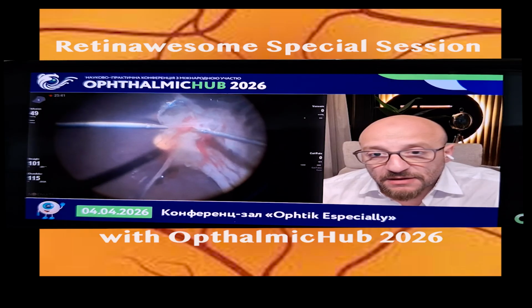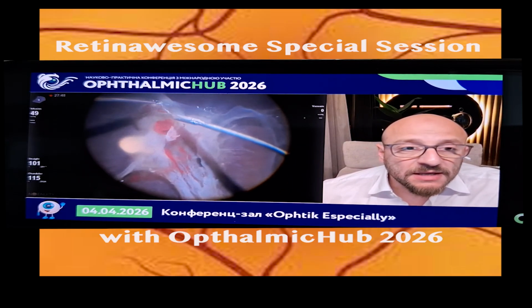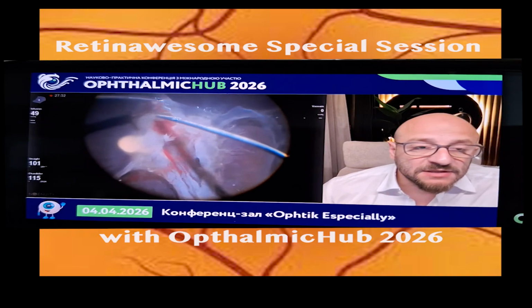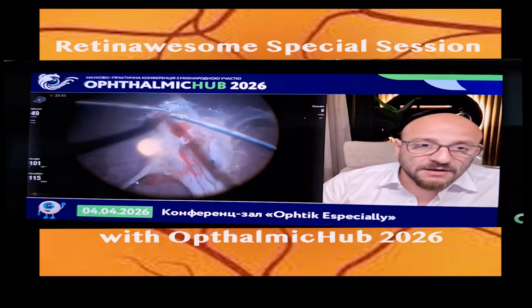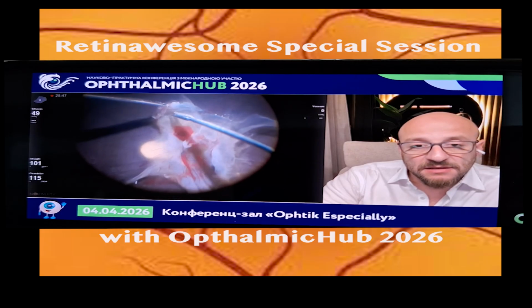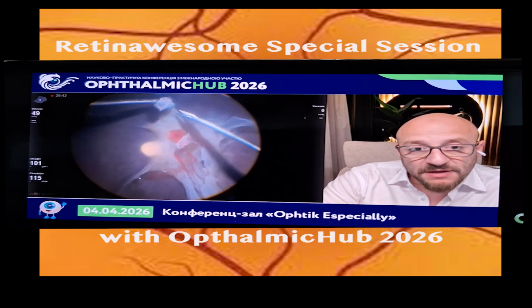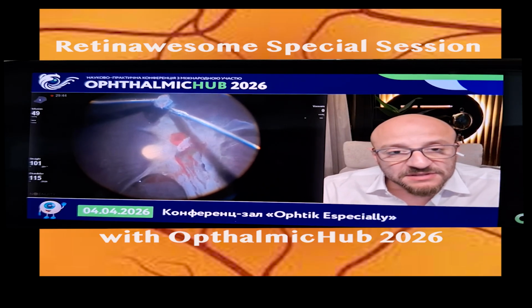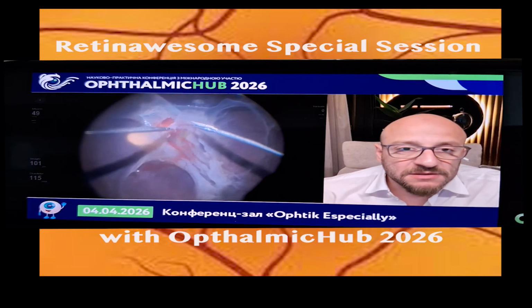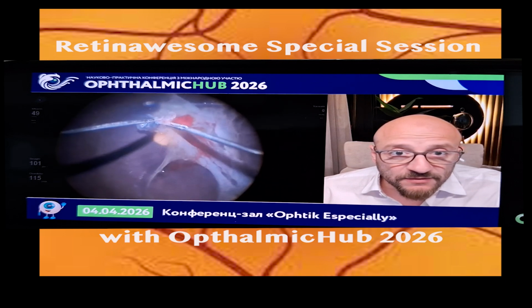As you can see, the posterior pole is folded, and most notably, the disc is covered by the retina. This is because the nasal retina is pulled by the prolonged traction, so that there is a fold of the retina over the disc from the nasal side going to the temporal side, which is very important.